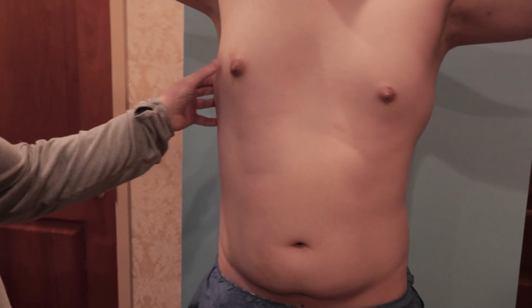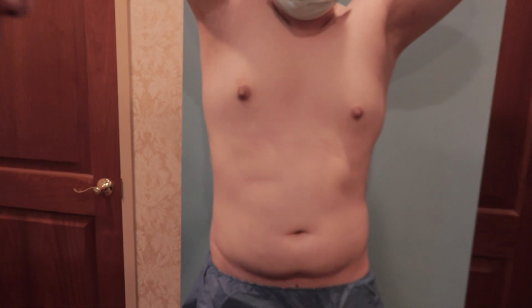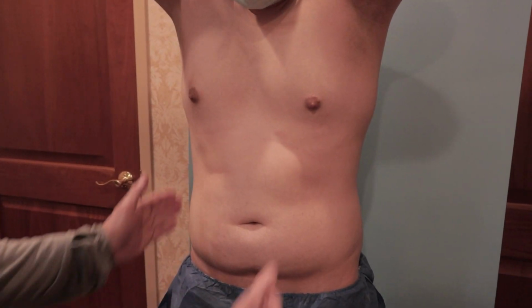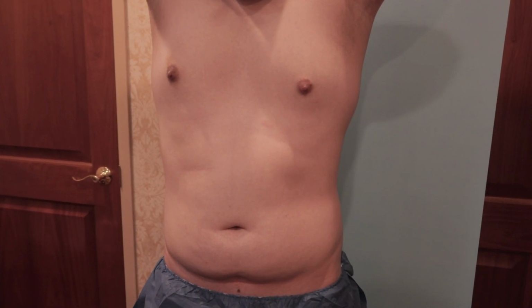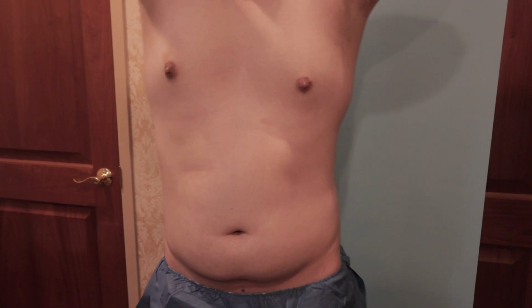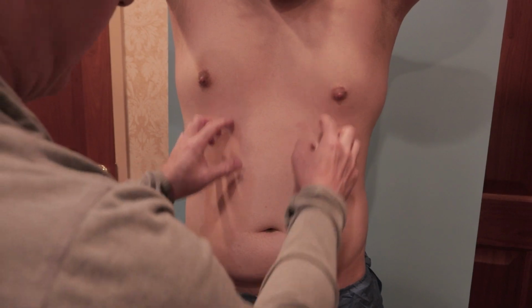Get all of this side boob out of here and create space between the pecs and the lats. Go on down, turn him on his side, get the lower back. He doesn't have much fupa there, but we're going to hit the fupa a little bit because I need to break up this line and get that great V to P, that midline linea alba and the semilunaris. Etch a little bit of the six-pack. Nothing crazy. He wants me to tone it down, and I don't know how to tone things down, but we'll put a leash on me and tone me down a tiny bit. He doesn't want those rock-hard abs, but we're going to whittle it down and give him just a hint, so I can make him symmetrical.